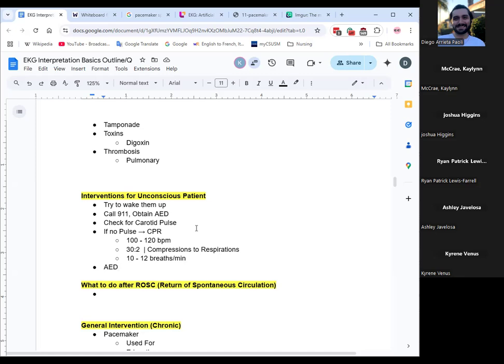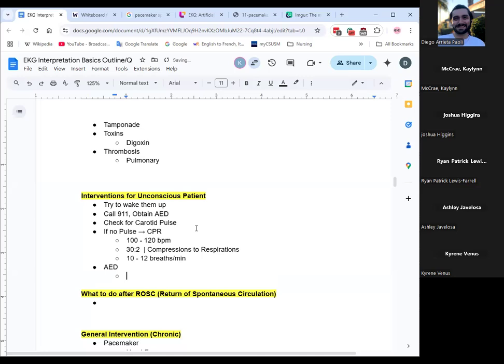So just make sure that when the AED is detecting a rhythm, you stop CPR, or else it's not really gonna detect the rhythm very well. And especially, I think this is a Kaplan question: what's the most important thing when you're about to deliver a shock? They give you four right answers, but one of them's extra right. I hope it's what I think it is. It's not to say clear. It's to look and make sure no one's touching.